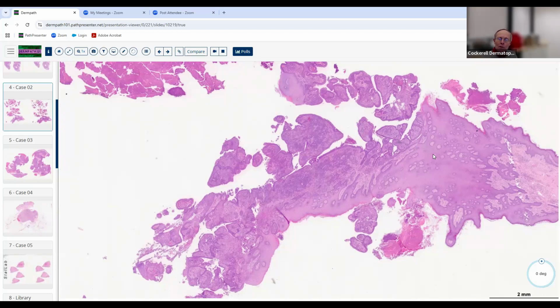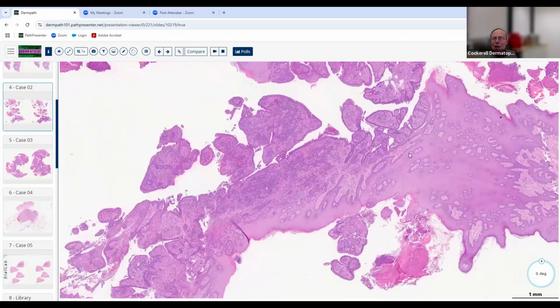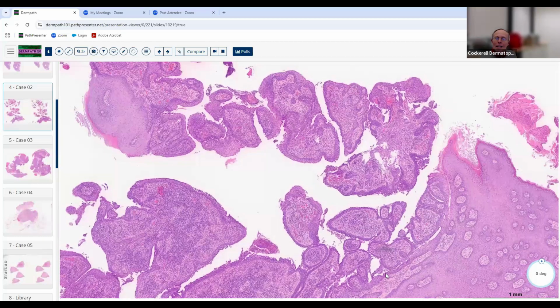If you take the same sort of lesion and stick it on the breast, and it's more endophytic, but they still get sort of an erosion a lot of times, and it looks a little bit like a hidradenoma papilliferum, we call that a nipple adenoma, or erosive adenomatosis of the nipple. And that's also got apocrine differentiation. The breast is a giant apocrine gland, basically. If you look at breast glandular tissue, it basically looks just like apocrine tissue. Obviously now it's a structure that's secreting milk, but ultimately it comes from apocrine cells originally.